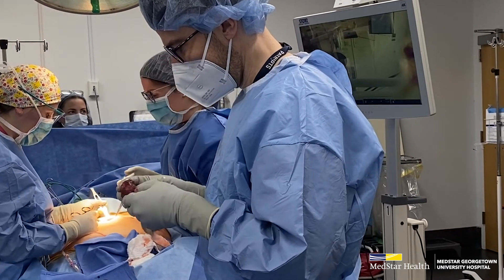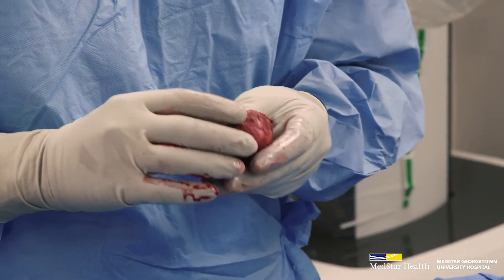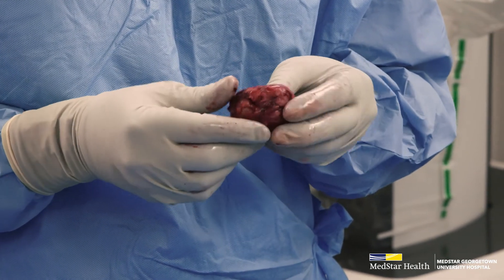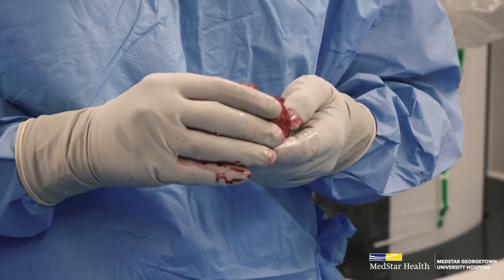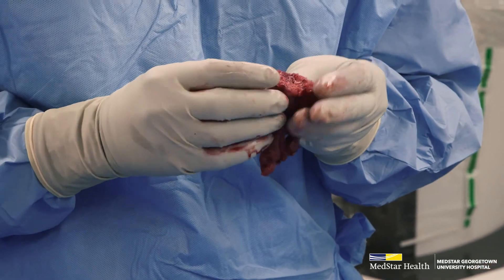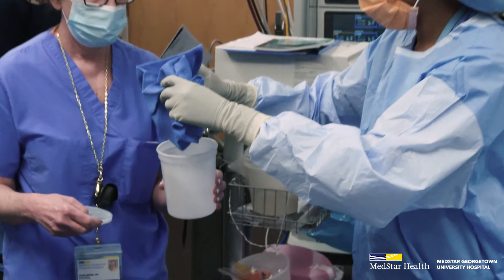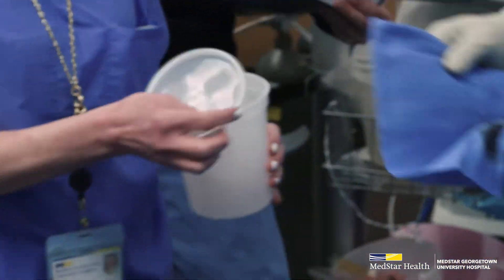After the case, I will always look at the prostate. What I'm looking for once the prostate is out is to make sure it's intact and how much nerve tissue I was able to spare, so I have a good idea of how successful we were. The prostate then goes into a container and to the pathologist, who tells us the most important thing — the stage of the cancer. The patient can go home in a day or two.